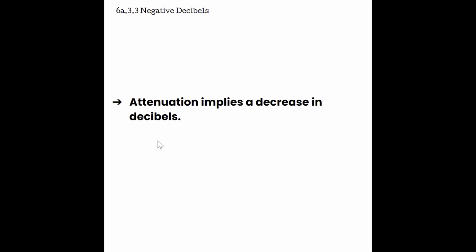The 60 decibel of my normal talking voice compared to the 30 decibel of my whispering voice is a change of negative 30 decibels, which means that my whispering voice is 1,000 times less intense than my speaking voice. And here is why. There are again two rules when decreasing decibels that you're going to need to know for ultrasound physics.